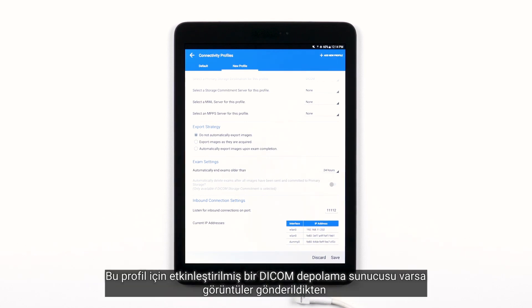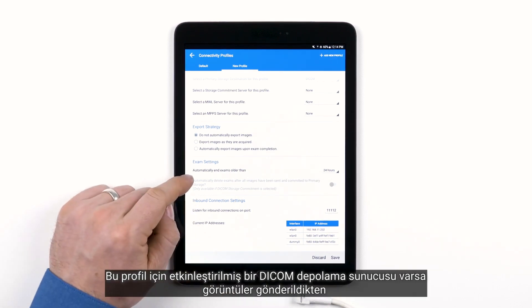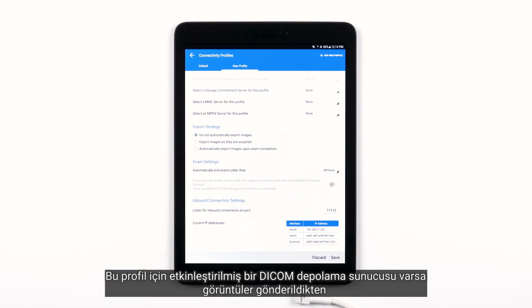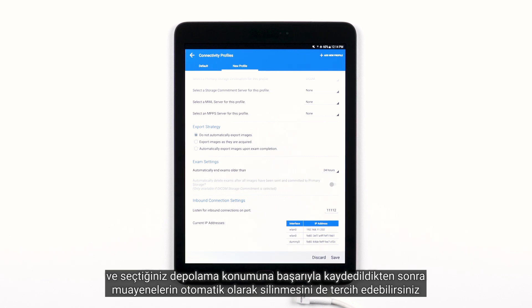If you have a DICOM storage commitment server activated for this profile, you will also have the option to automatically delete the exams after the images have been sent and successfully committed to your chosen storage location.